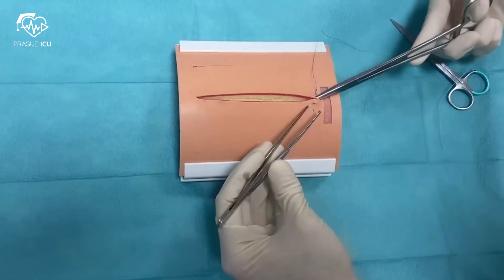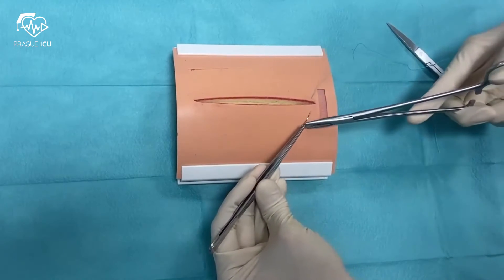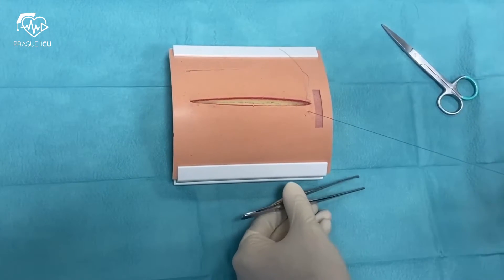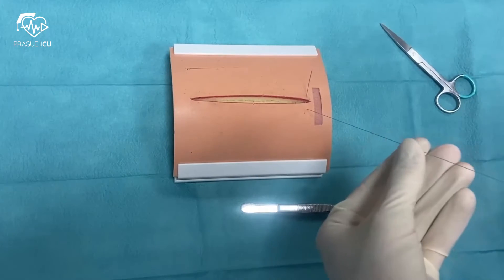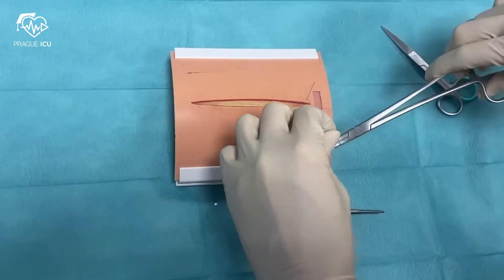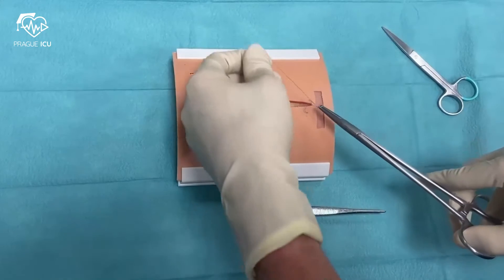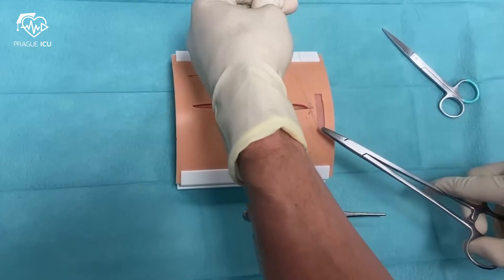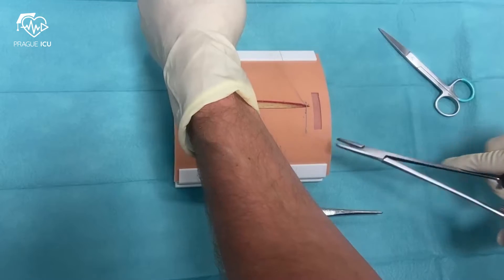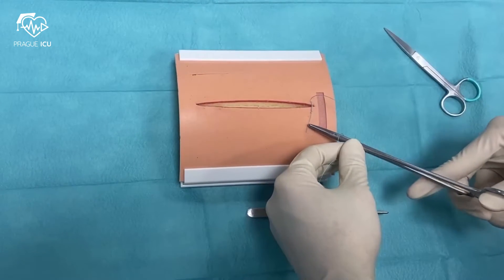You should pierce the tissue perpendicular to the upper and lower surface to avoid inverting or everting the skin. Every stitch ends with a knot that should lay outside the wound. Pay attention to tightening the knot with care, as too much tension may cause ischemia of the tissue.